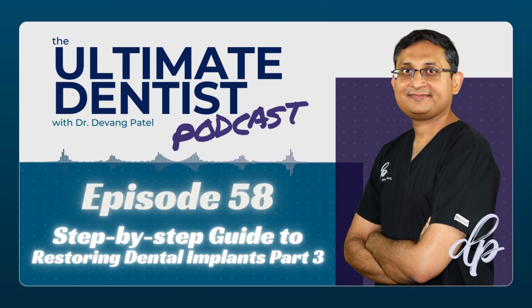Gold is quite expensive nowadays, so we do a custom abutment in chrome or titanium. But the problem is it's very difficult to stick porcelain, like feldspathic porcelain, onto a titanium abutment. It will not stick. So you need something like a PFM, porcelain fused to metal crown, and that's why the technician will mill the abutment in chrome, put porcelain on top and fire it in a furnace. So you get literally a PFM crown, but it's screw retained into the implant, and that's a one piece implant.